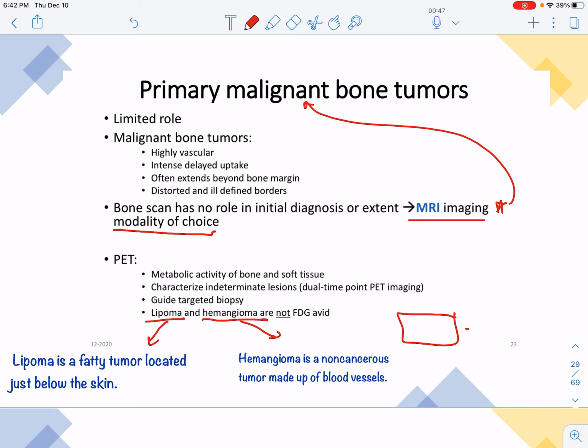لو عندنا radioactive material مع إيش الماتيريال اللي إحنا حطيناها معاه، عشان كده يختلف على حسب الماتيريال اللي هنحطها معاها. It's gonna be taken from the organ that we want or not. Well, we need to know what we are actually expecting to see and the history, if there is any other condition that might like interfere with our scan or might like increase the uptake for the scan.